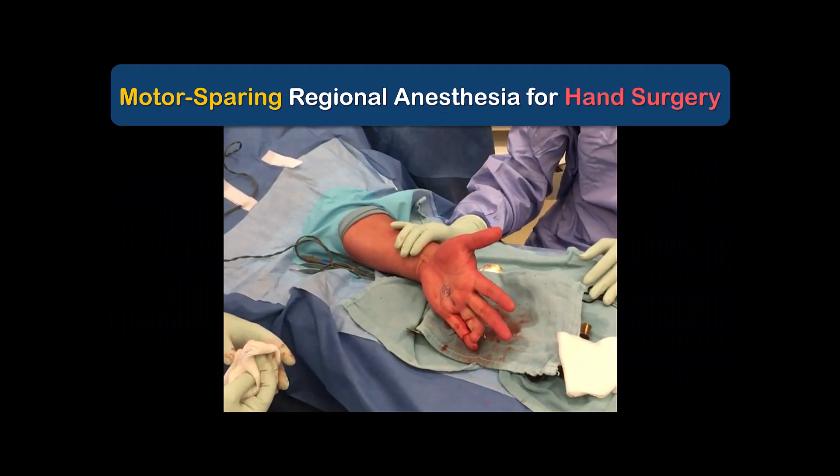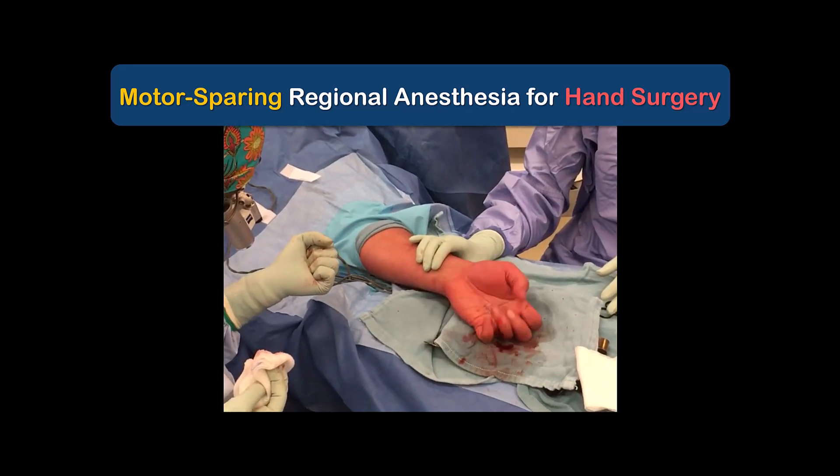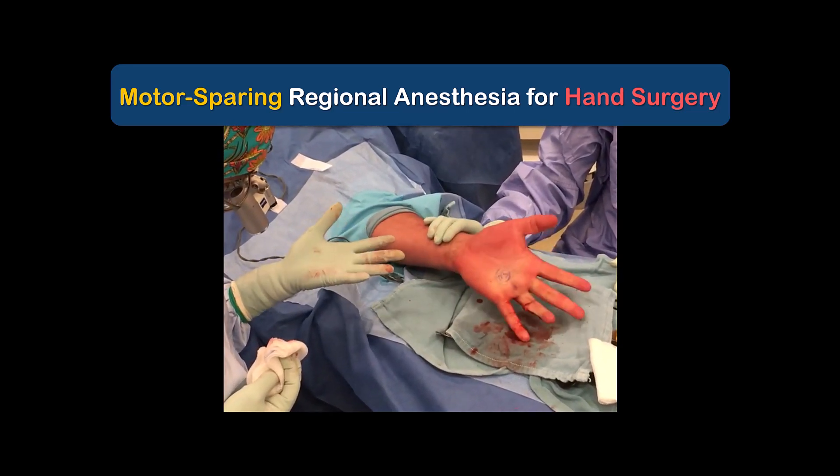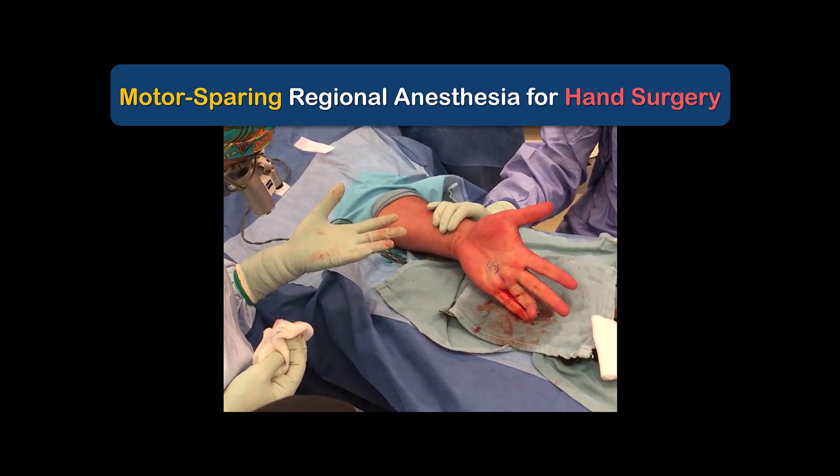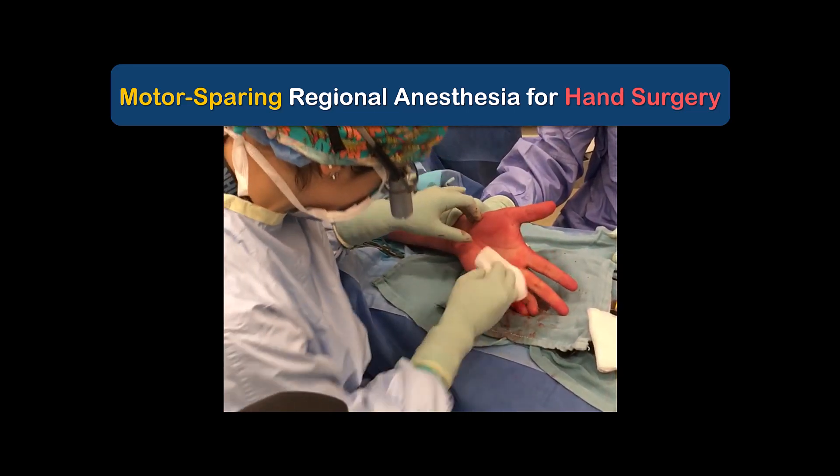This video will briefly describe how to provide motor-sparing surgical anesthesia of the hand, where our surgical colleagues want to have an awake patient who can move their fingers to command for intraoperative testing of movement.